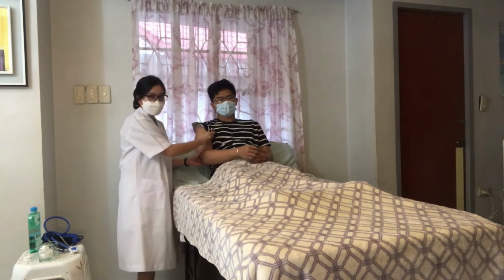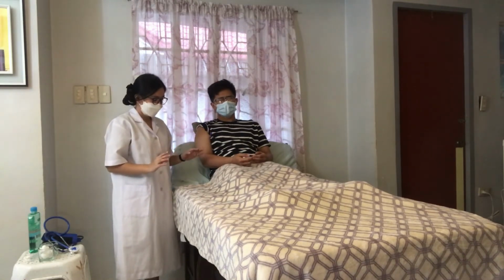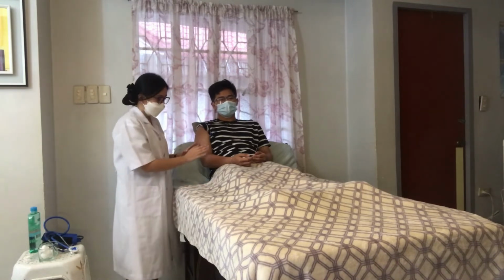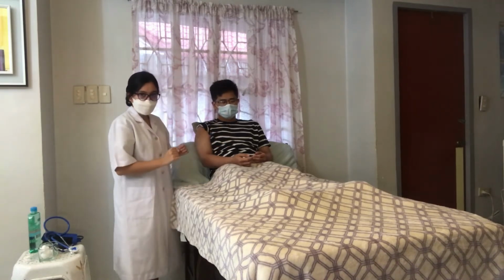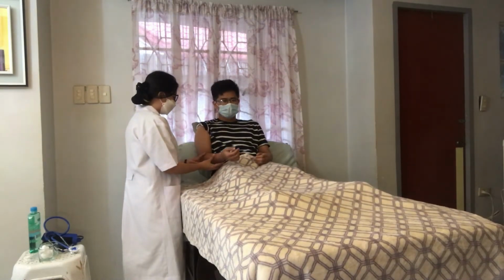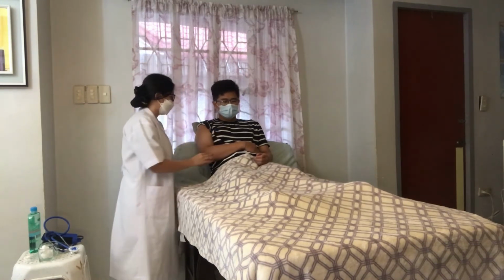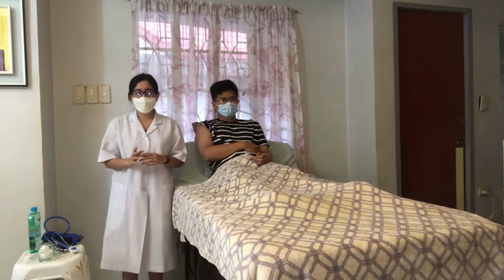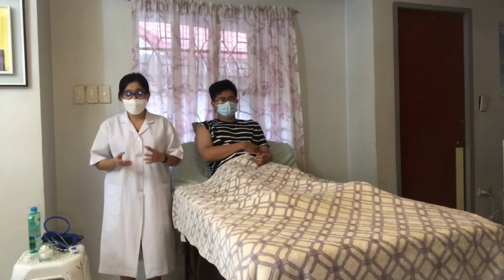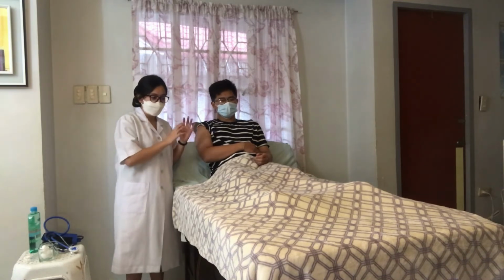Now after the thermometer is placed, we are going to assist the patient to place his arm across his abdomen so that it can hold the thermometer tightly. Sir, may you please hold your arm across your abdomen so that it will hold the thermometer. We must note that when a patient is irrational or is very young, we have to remain holding the thermometer to prevent it from falling.